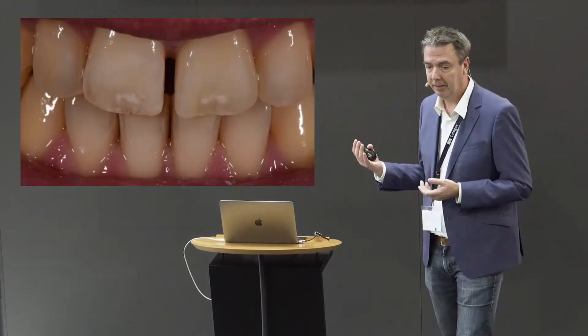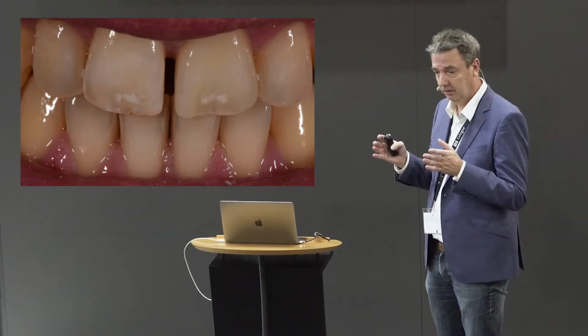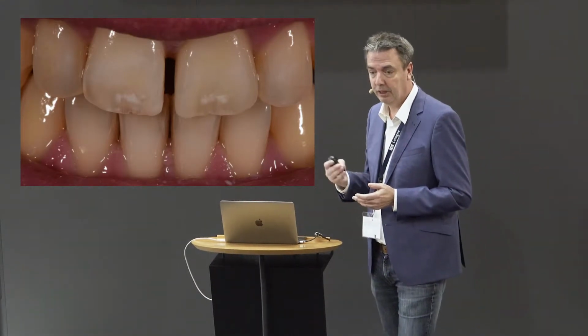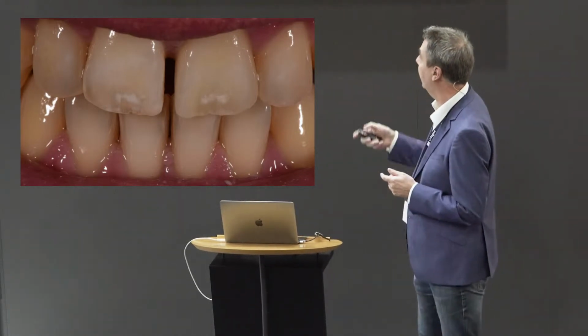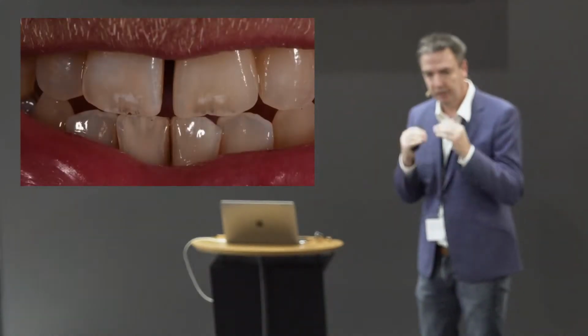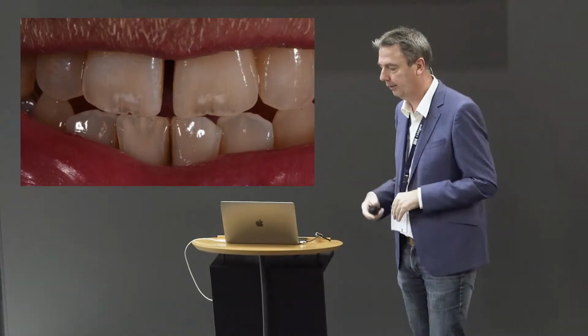You see, this is the final result of this case. Left-hand side, natural tooth structure, right-hand side, the crown. This was done with the Ivoclar material, we did this in a live patient course. And as you can see now, when the patient goes into protrusion, it fits 100%. There's absolutely no risk of fracturing.